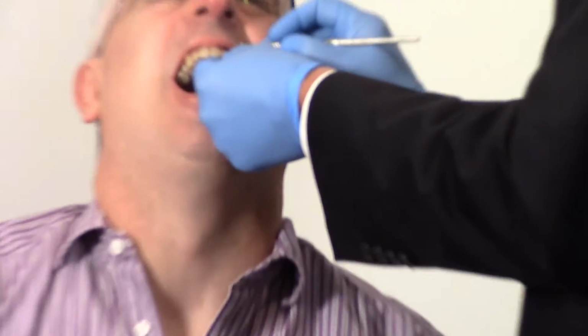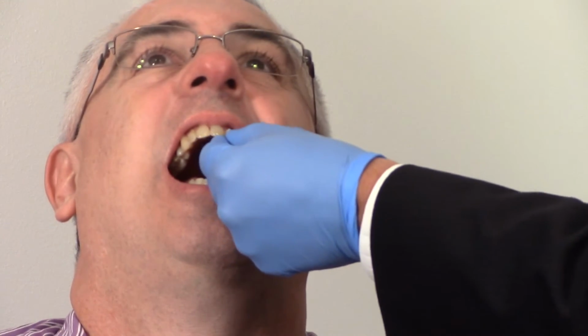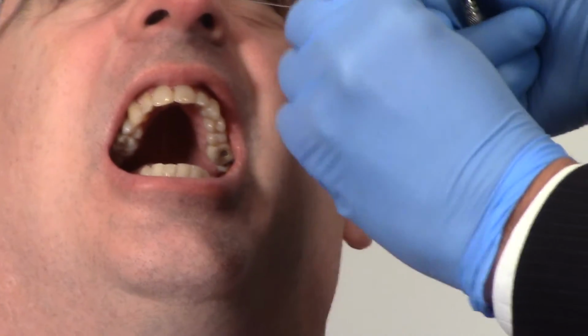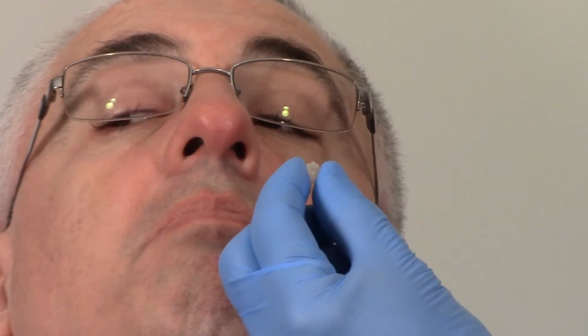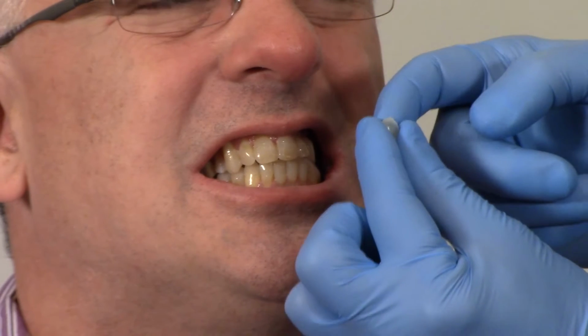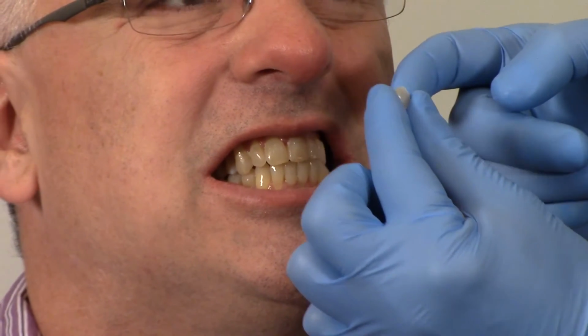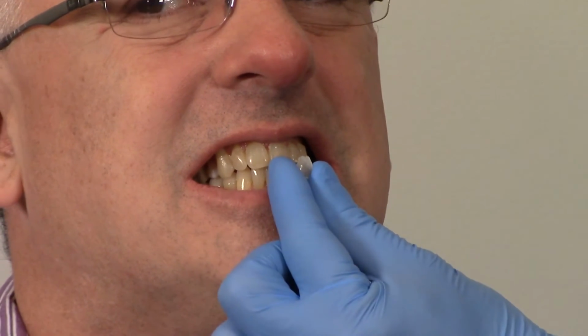Okay. So let's go ahead now and pop off this veneer. All right. And it took, what, was it a minute 35 seconds? I think it was a minute 35. Yeah. So here we go. Okay. Pop this off. And check this out, ladies and gentlemen. This is his veneer. And if you look at this next to the tooth, look at how translucent it is. You can see my blue glove there. See that? And it looks just like a veneer.